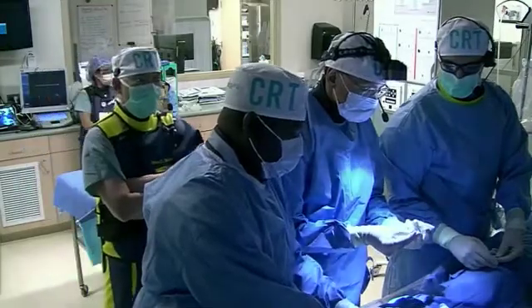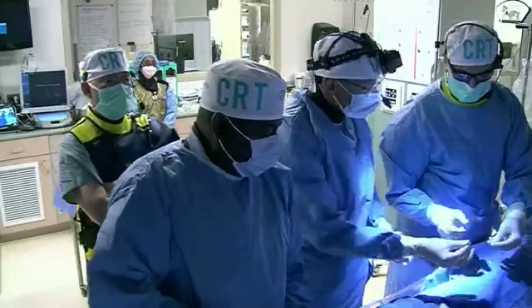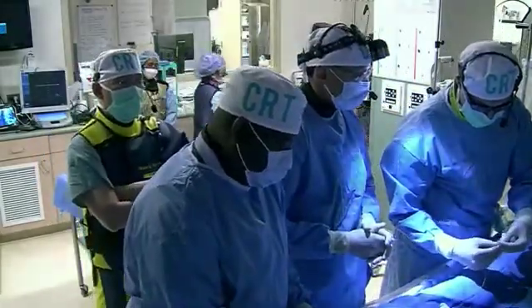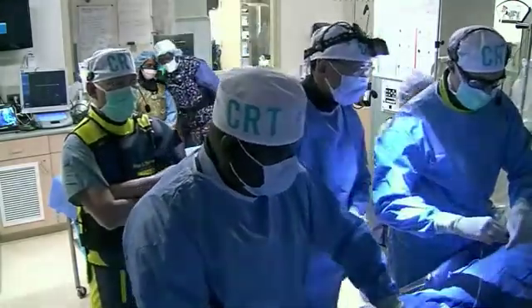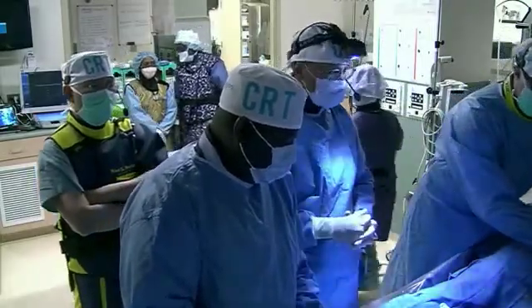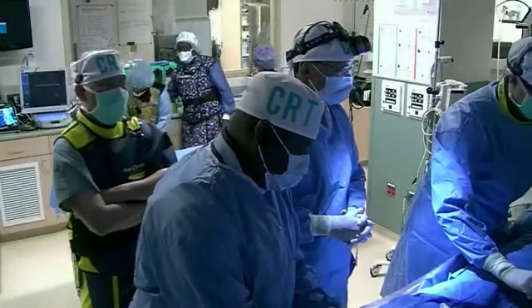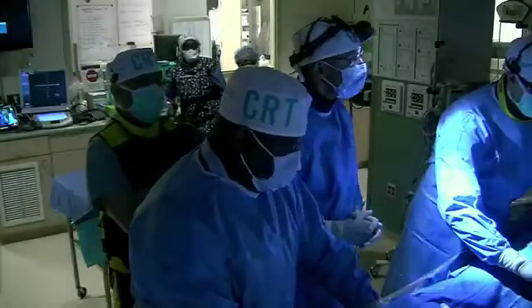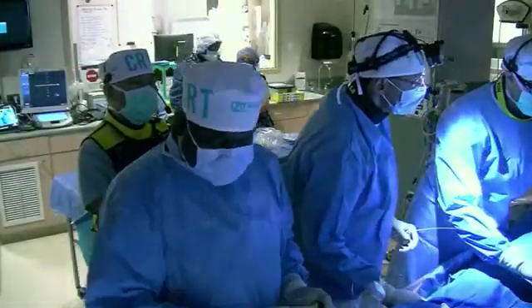One important point here with the OCT is that to optimize your shockwave, there are several things. You want one-to-one balloon to artery size, and you can't get that from an angiogram. OCT gives you precision with that. Number two is you want to focus your 80 pulses, if you're going to be conserving dollars, where the calcium is. It's a lesion that could be long, but you want to focus it exactly where you want, and with co-registration, you can do that with OCT. But this one looks like a very small area. You know that from OCT, you wouldn't know that from an angiogram necessarily.